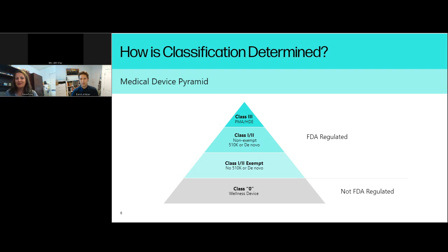So it's a constant process. That's the answer. It's a constant process. Yeah, and I always say this, being from a startup and also an additive, that a common quote I always repeat is, everyone wants to be the first to go second, because the first one has to go through all that additional work and effort until someone like the FDA says, okay, we kind of get it now. We can lessen some of the requirements and things like that.